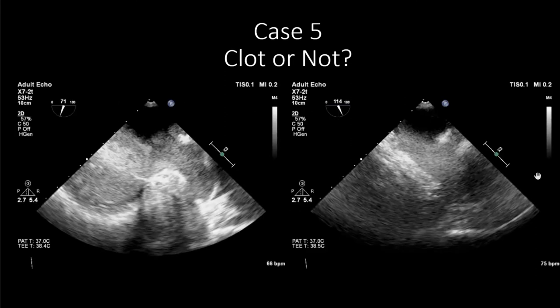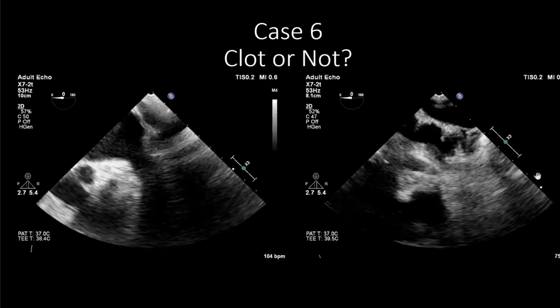Contrast — I know this is outside the 3D — if we have a suspicion and can't clear it, we do contrast. Bring your mechanical index down. Look at the left atrial appendage as the contrast comes swirling in. If you have a small thrombus, the contrast will fill the appendage and surround it, so you want to look as it comes in. Switch into different views as you do that. This patient had no thrombus. So if you can't see anything, use your different techniques to visualize and make sure you're not missing a thrombus.